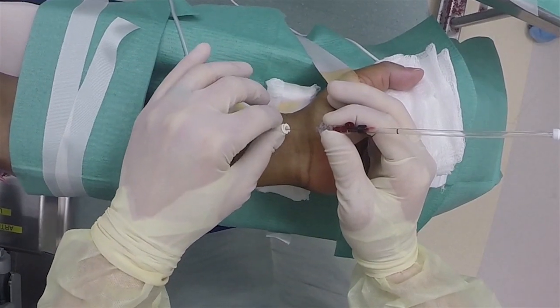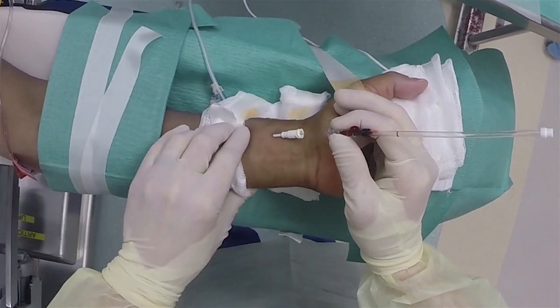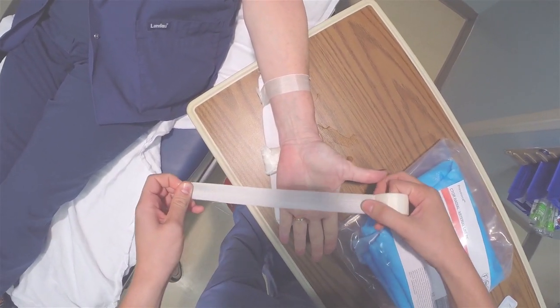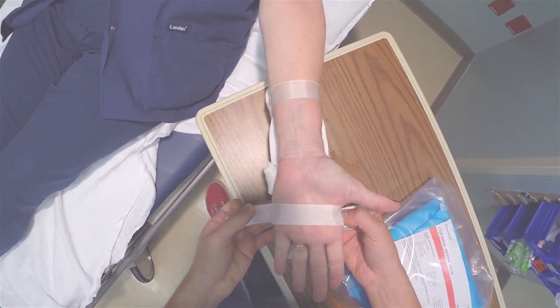In order to improve your chances of success, proper positioning is key. It is standard to immobilize the hand on an arm board with a roll of gauze underneath the dorsal aspect of the wrist.